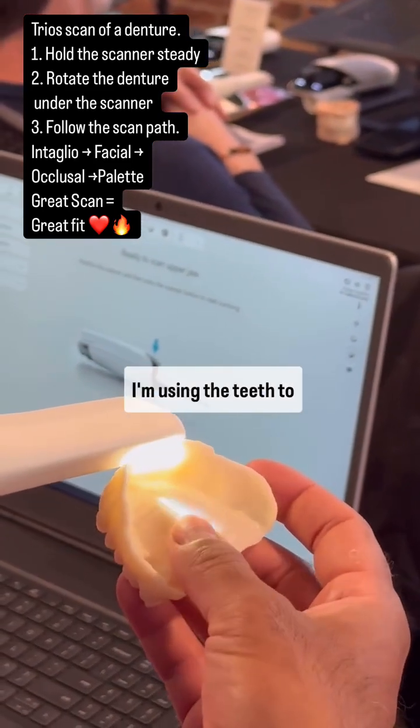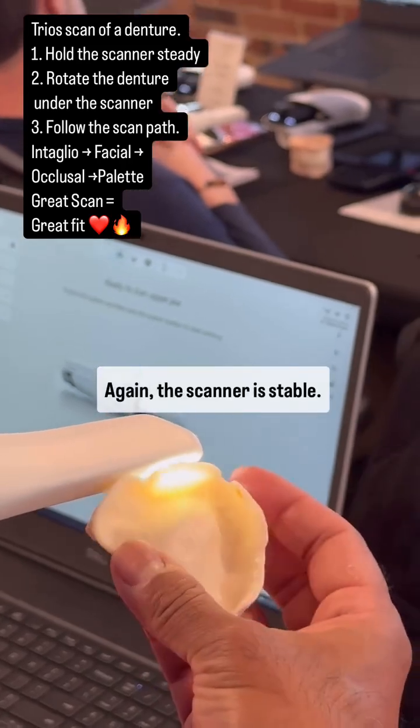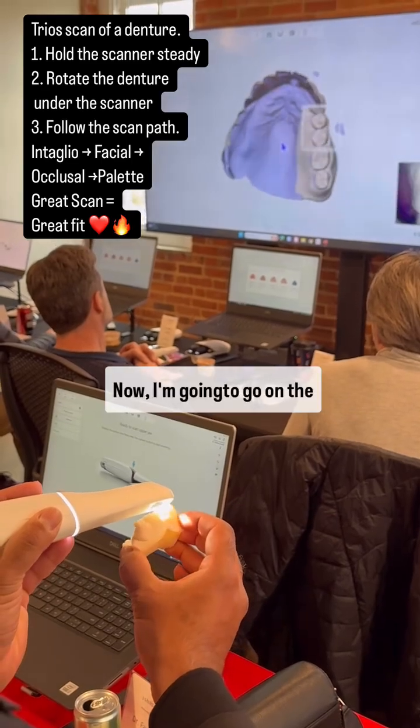I'm getting the teeth to stitch. I'm using the teeth to stitch. The scanner is stable — I'm only moving the denture with my fingers. Now I'm going to go on the teeth.